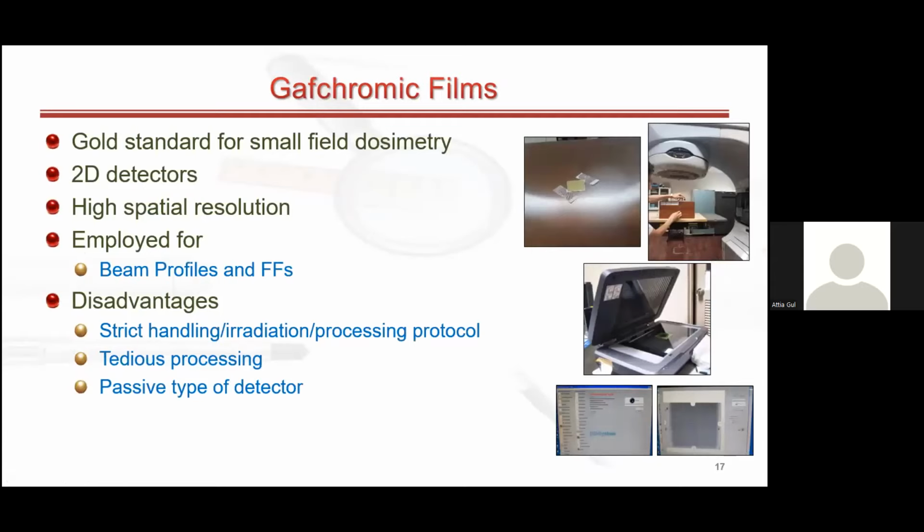But the reason we use it as gold standard is that after all this effort and careful handling, it gives the field output factors that are most accurate.